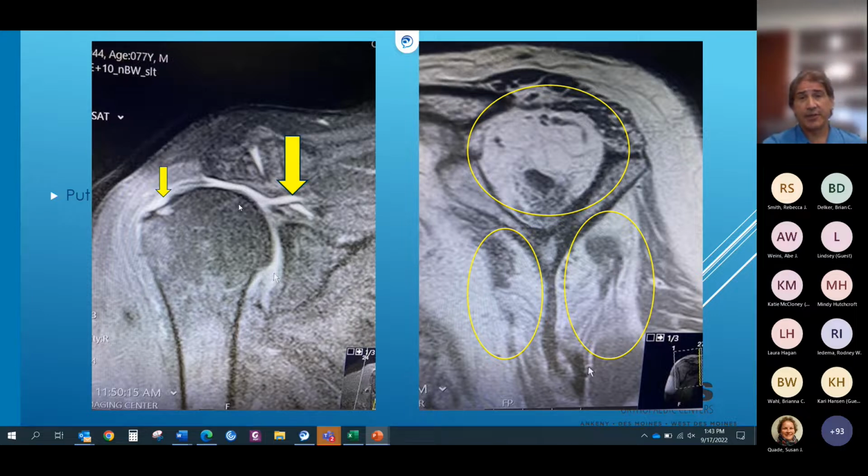There's some other options, just as an aside. There is something new that I haven't done where they put a balloon in there to try and just kind of make a spacer and a fulcrum so that you fill this balloon up, and then hopefully that will allow you to lift up your arm without pain.